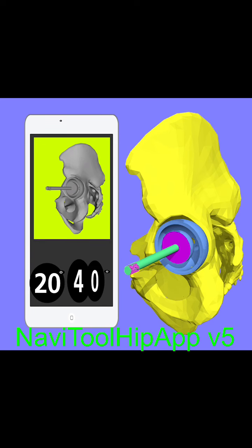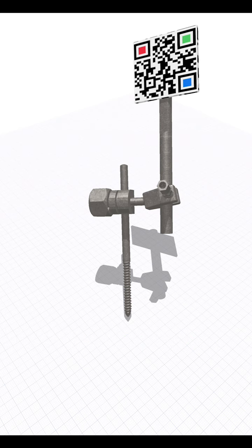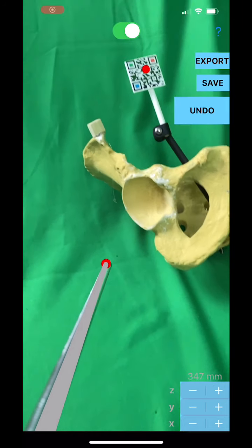The app starts after recognizing the QR code image attached over the passive sensor. A built-in dedicated QR code image should be exported from the app and printed on a common color printer, preferably as an adhesive label, and attached firmly to the passive sensor's dedicated surface plane.